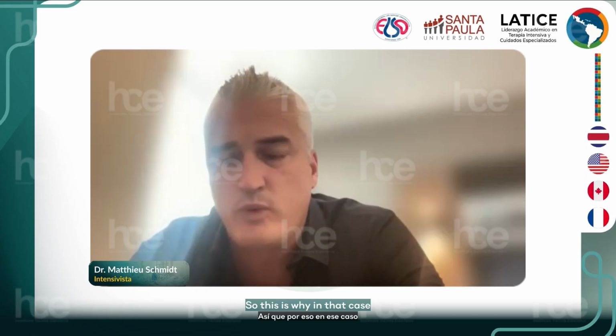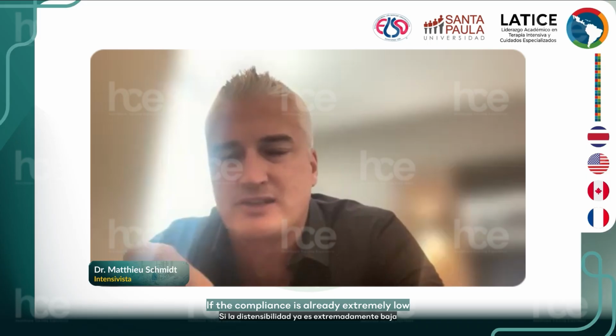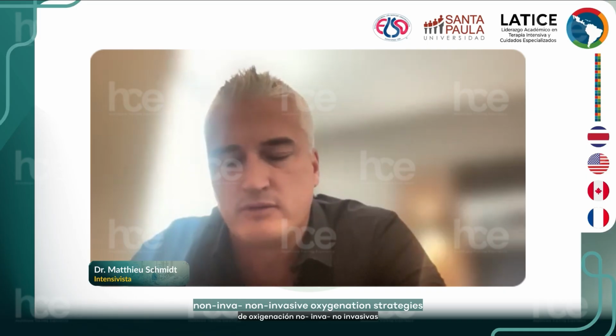So this is why, in that case, we pay attention to what happened before being intubated. We frequently ask the referral team what the compliance is at day one of intubation. If the compliance is already extremely low, it probably means that the respiratory mechanics is already very impacted by the long period of non-invasive oxygenation strategies.